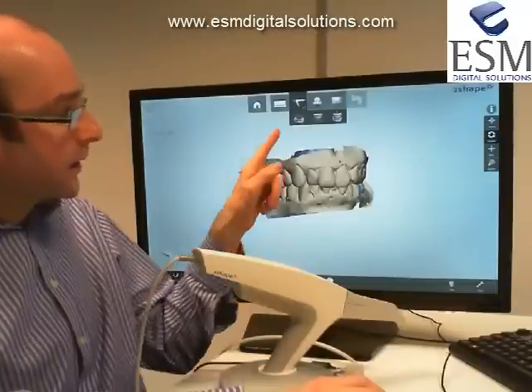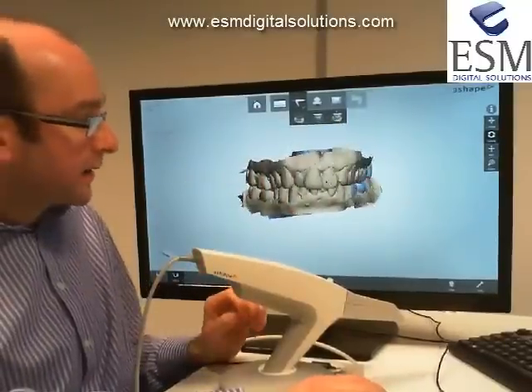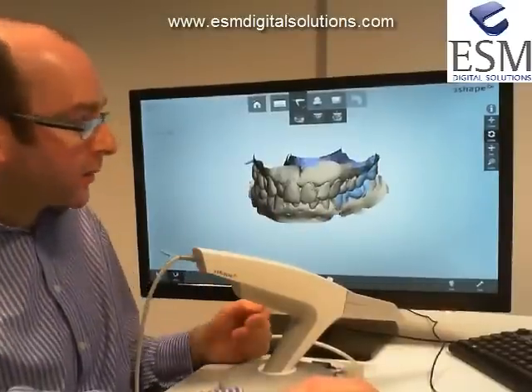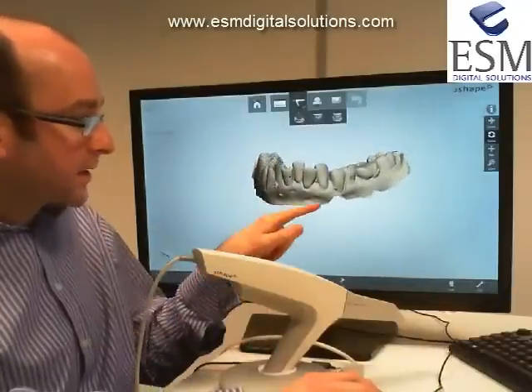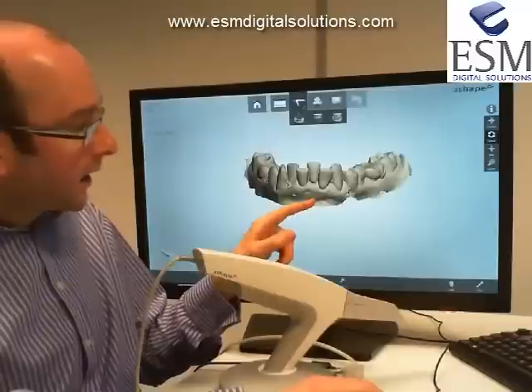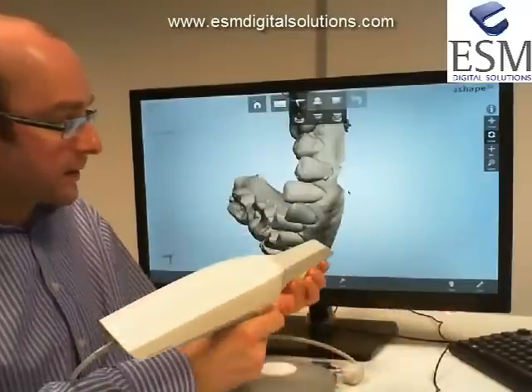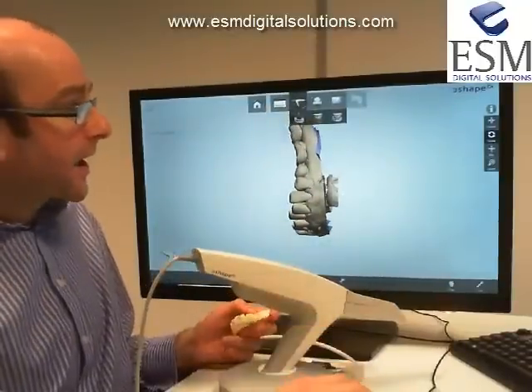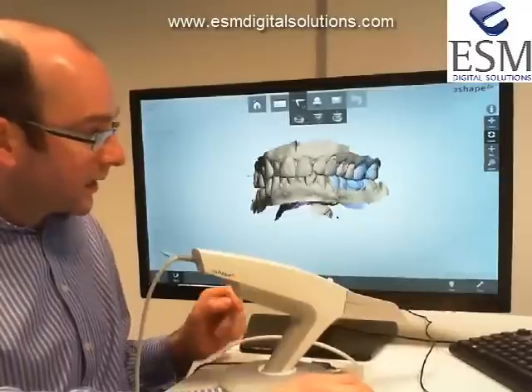Click done. We've got a green tick on the lower arch, a green tick on the upper arch, and a green tick on the occlusion - we have completed our scan. If you notice missing detail anywhere, you can still go back. Select the arch you want to work on, click on the tooth where you want to re-scan from, take the scanner, go in, and fill the hole. When you go back to the occlusal scan, all of the alignment is still done - we don't have to redo anything - but we see the additional detail has been added.